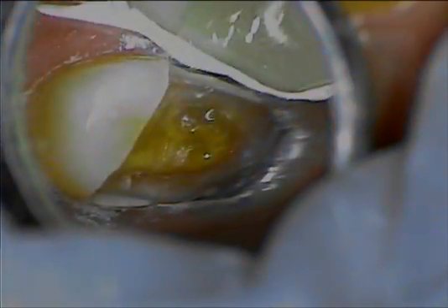After thorough rinsing, the tooth is lightly dried. We prefer a wet surface — wet bonding. We like to see water just glistening off the tooth but not pooled in any location.